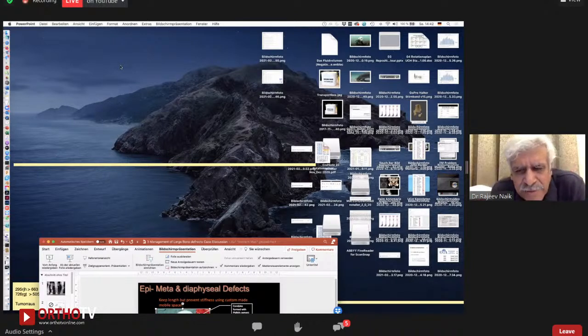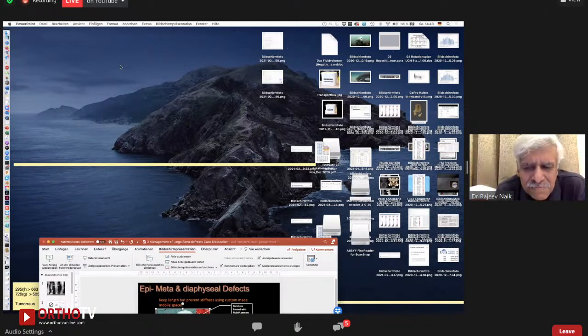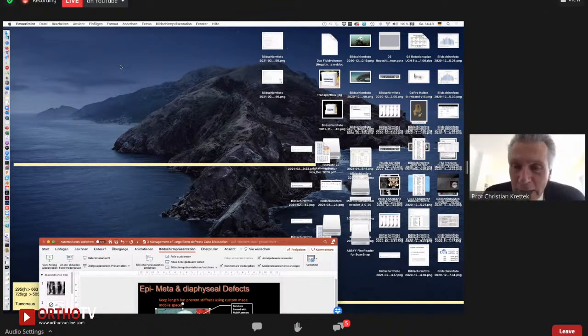Another question that has come is that the plate that was used contained all monocortical locking screws. Do you think that was the right thing to do in the first place? In the case with the screw pullout? Yeah, absolutely agree.